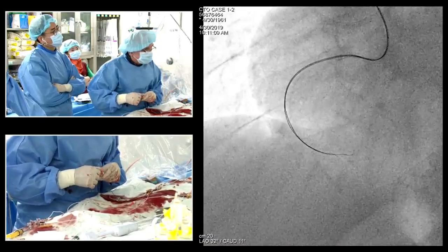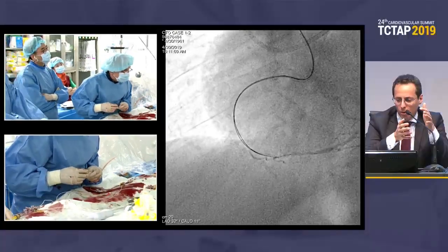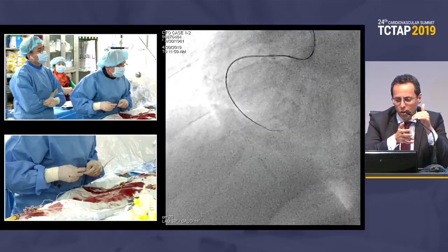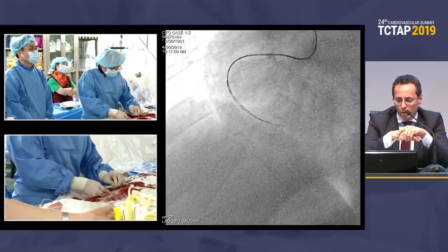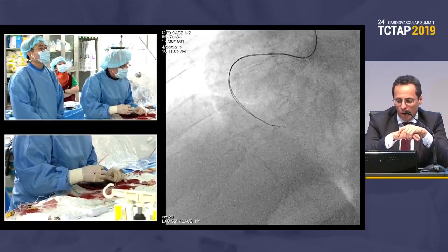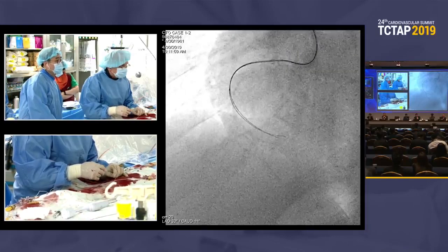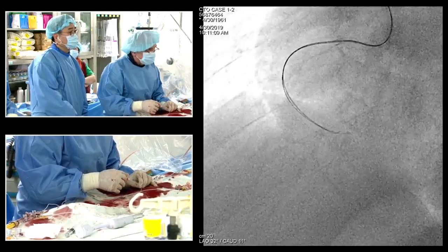So, Gerald, what I think at this point is that you start creating probably unnecessary hematoma, and you still have probably the possibility also of a septal connection. So probably my choice would be now to try septal connection, and if this doesn't work, maybe go back to the parallel, but before going for the epicardial. The risk of creating a little bit of hematoma distally and then unnecessarily long stent length probably is not worth continuing on antegrade parallel wire. Yeah, well, it's a very diffuse disease, so I think it fits in the context of this morning session with the distal bed.